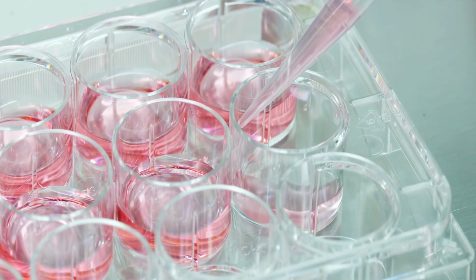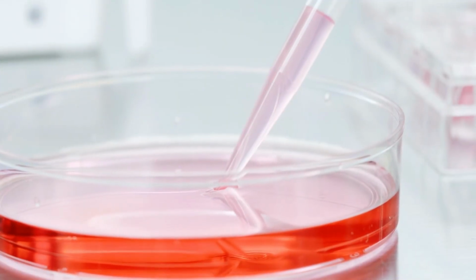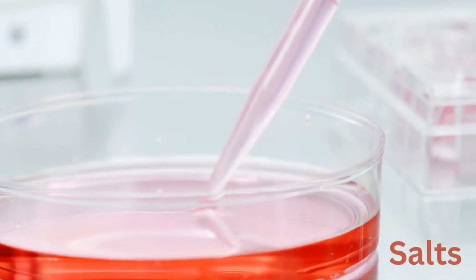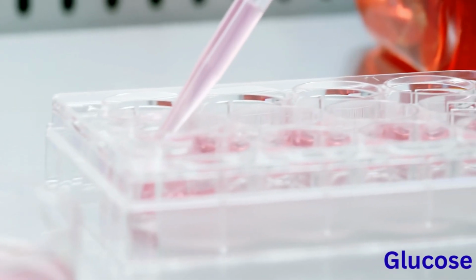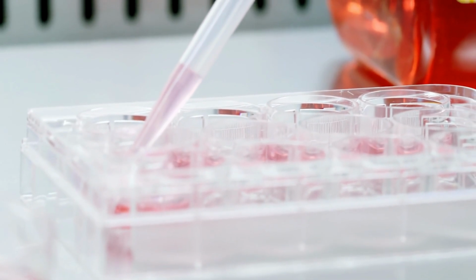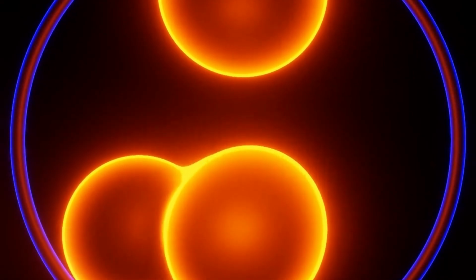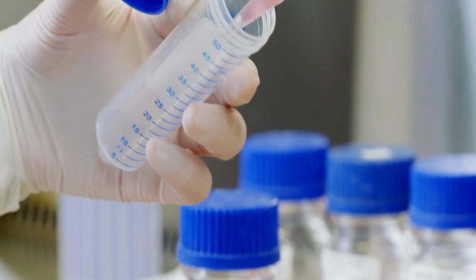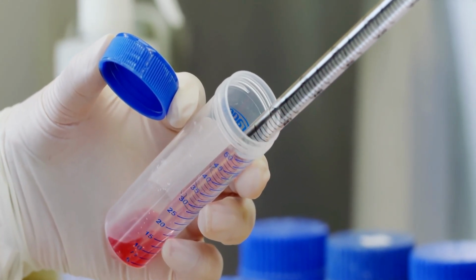Cells grown in culture depend entirely on the culture medium for survival. Choosing the right medium for your specific cell type is one of the key steps in successful cell culture.